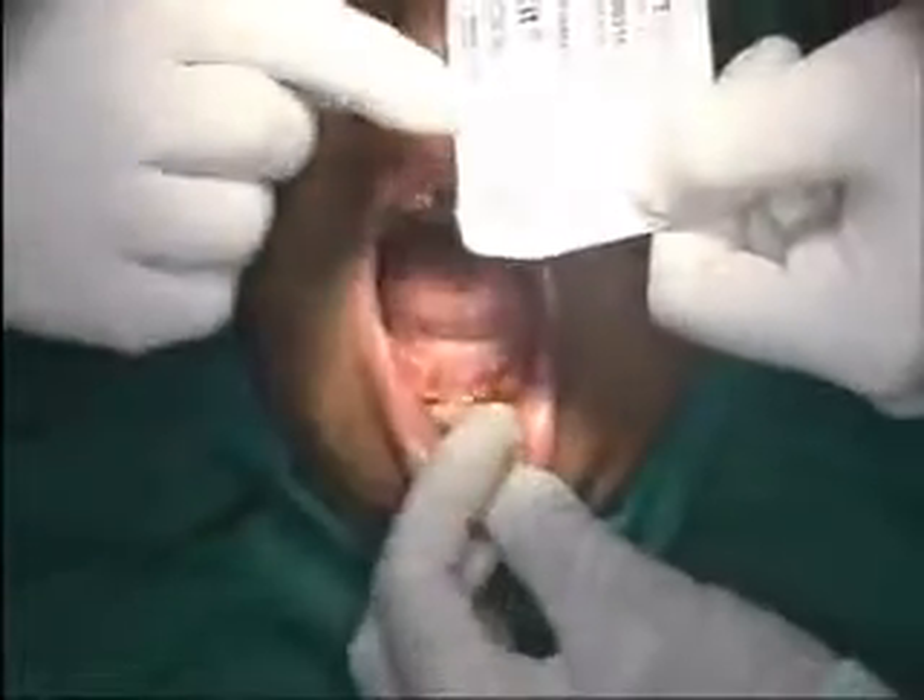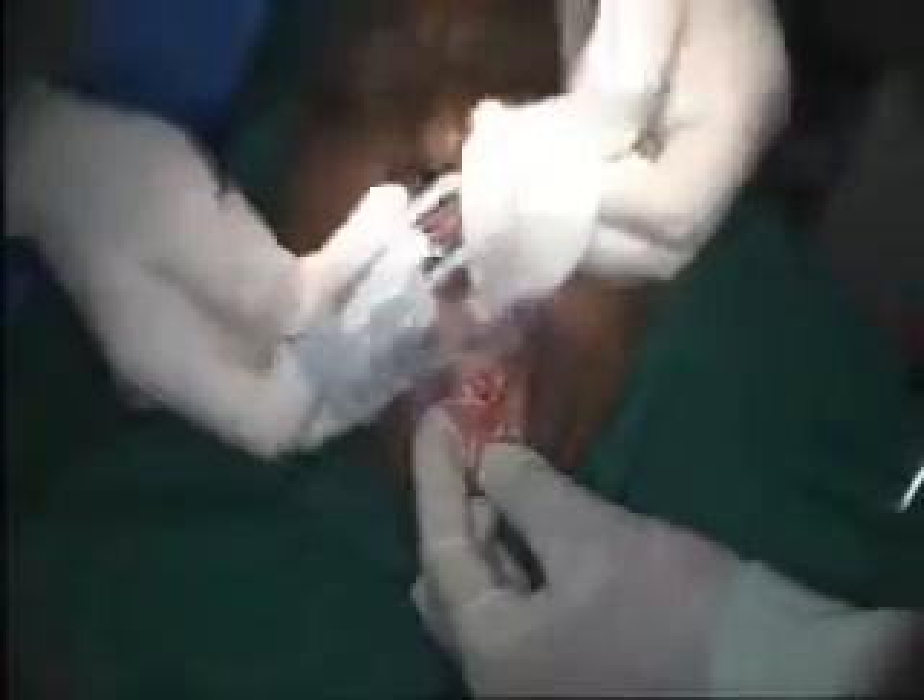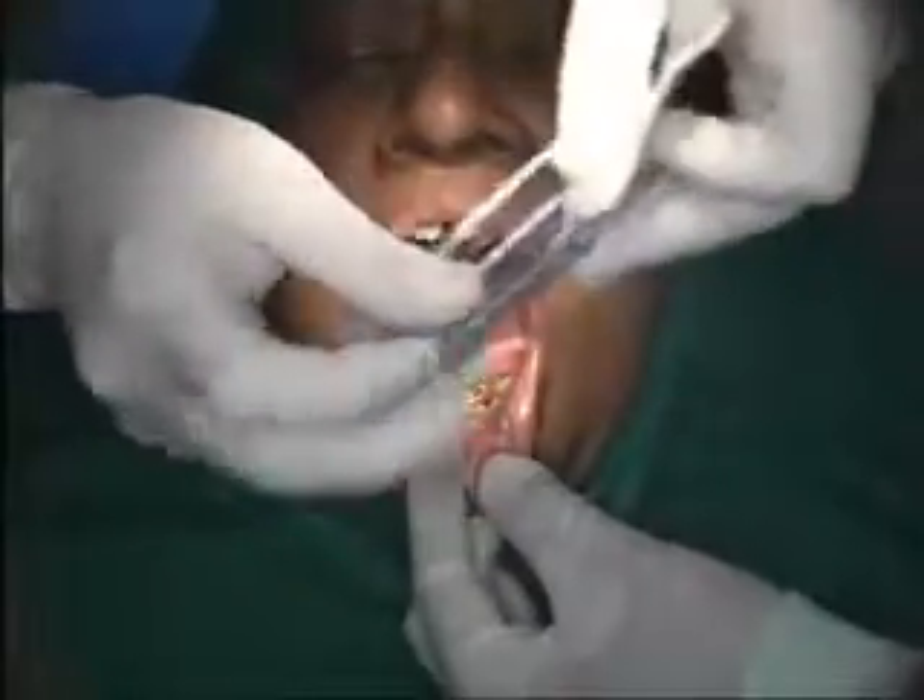European norms. Then you open it up. Now this is new — this is Osmoactive packaging. Wet implant. Now you are receiving implants that are wet.